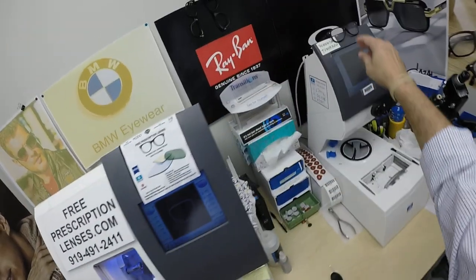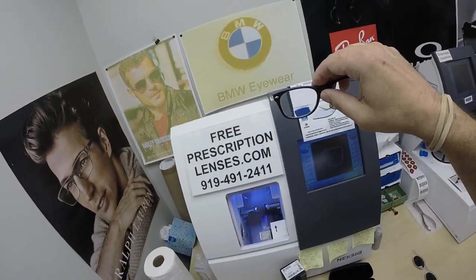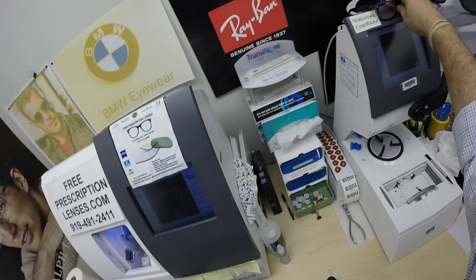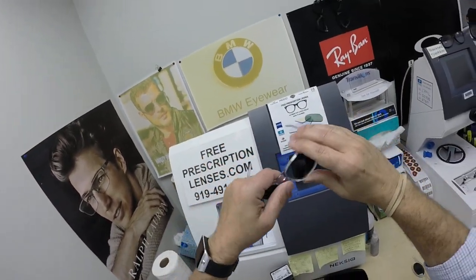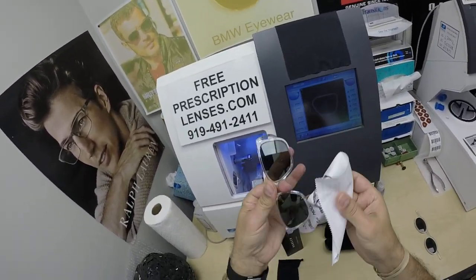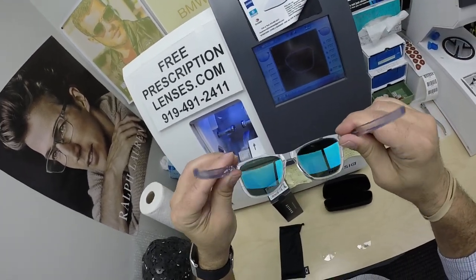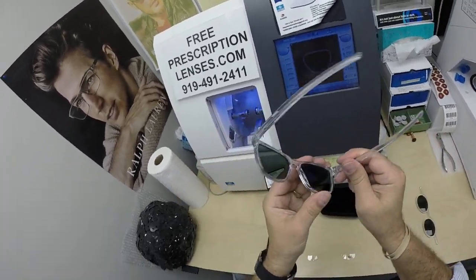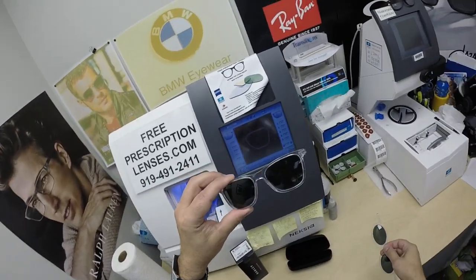Now, Jeremy one-upped my oldest trick in the book. My trick is to take a pair of sunglasses — like the Ray-Ban New Wayfarer — take the dark lenses out and put clear lenses in. He did just the opposite: he took a frame with clear lenses and turned them into sunglasses. He got the Zeiss polarized green lenses with the back surface Duravision Sun back-surface anti-glare coating.